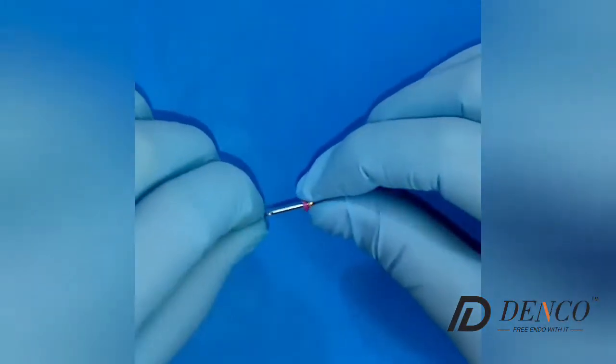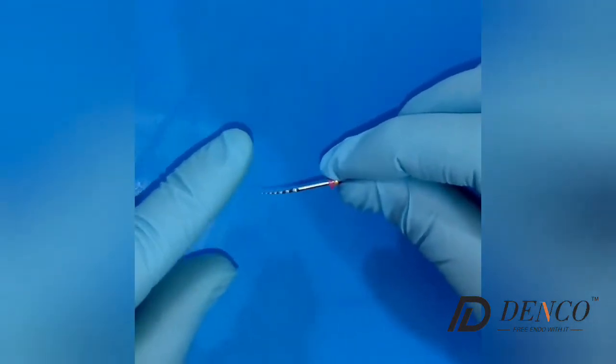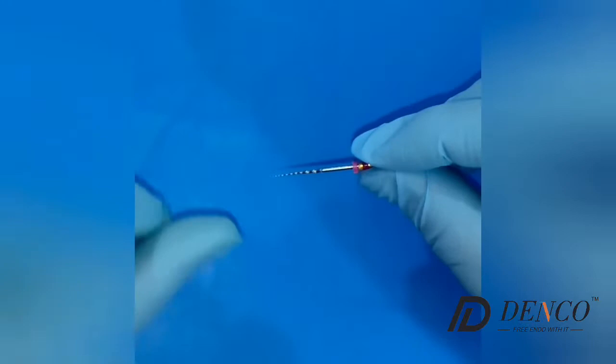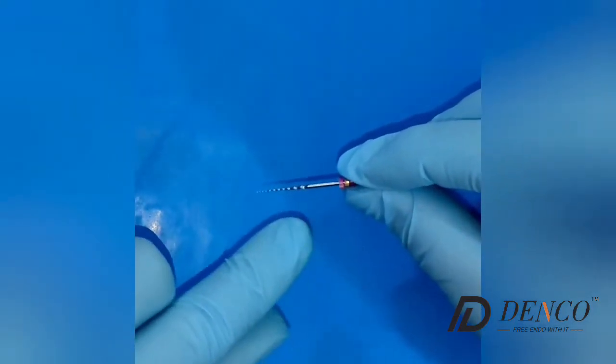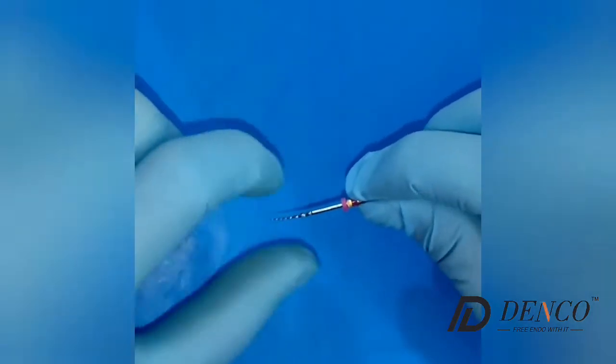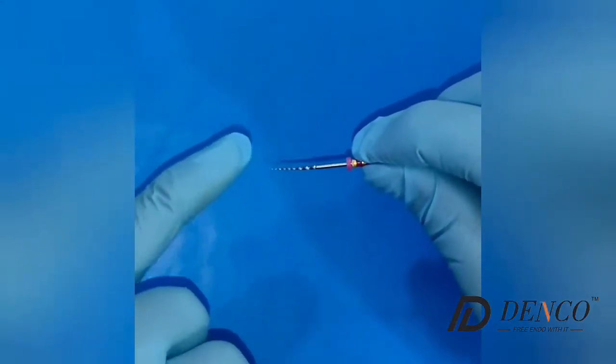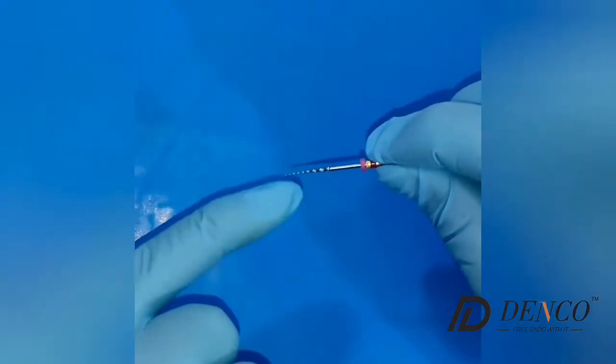Then we can proceed to use the S1 file. It's only going to treat the coronal and mid part of the canal — only those two thirds of the canal. It's not active in the tip of the file.